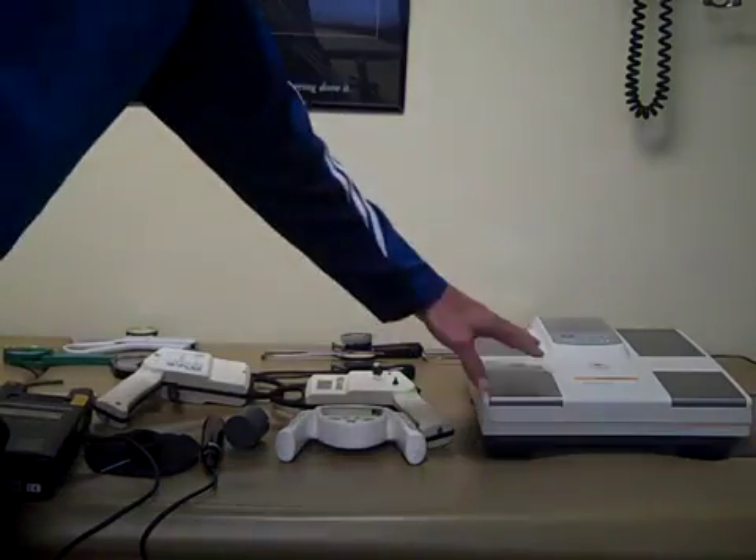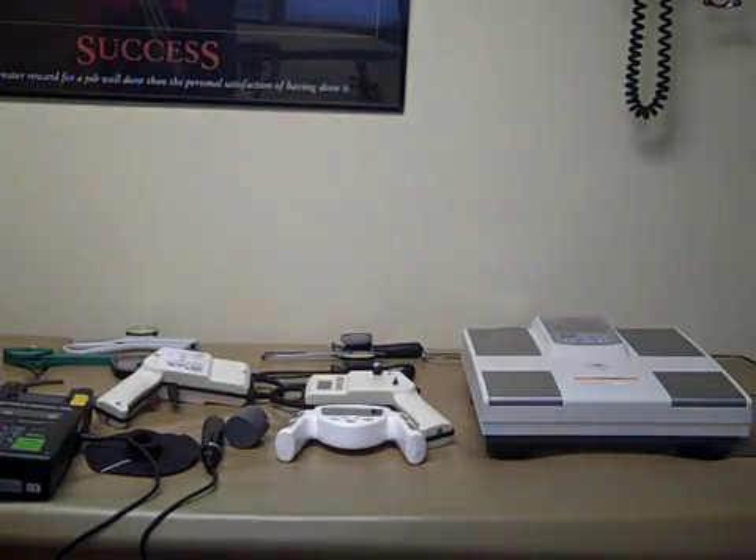Lastly, we have the scales. You can actually stand on them barefooted and they work on electrical impedance, and again can give a fairly good representation of where your body composition is. You would have to designate whether you are an athlete or a non-athlete to get your readings — that's one of the most important pieces.